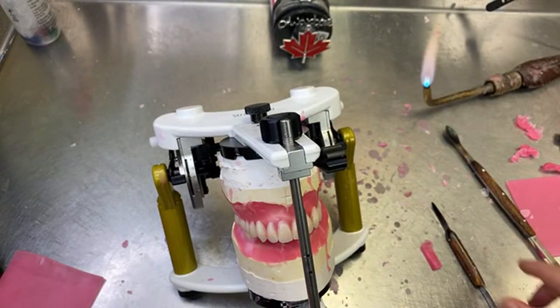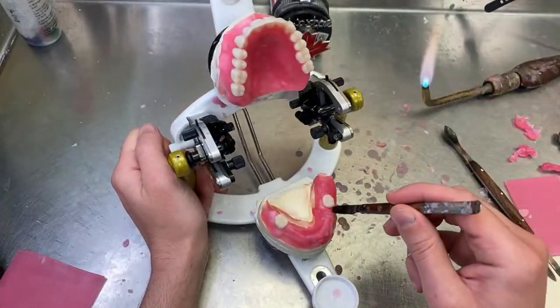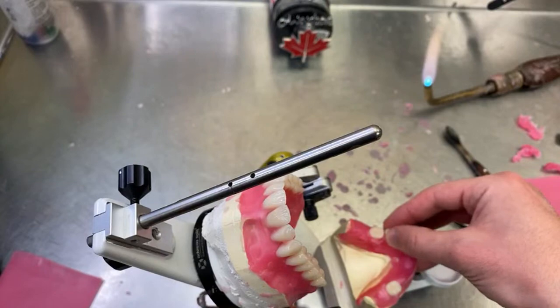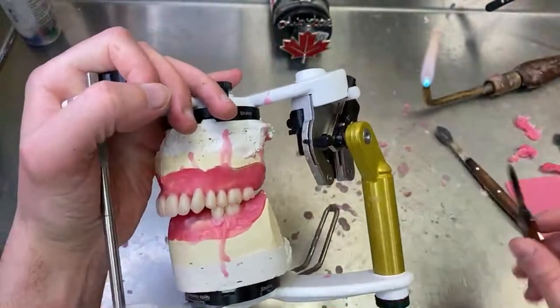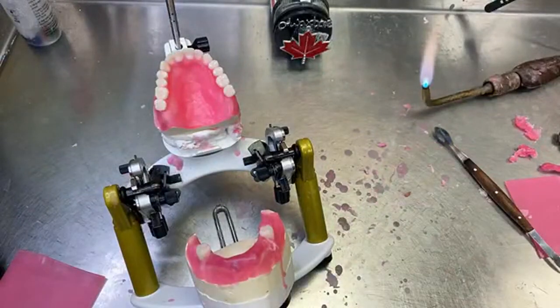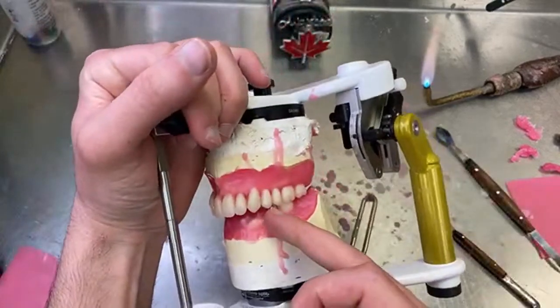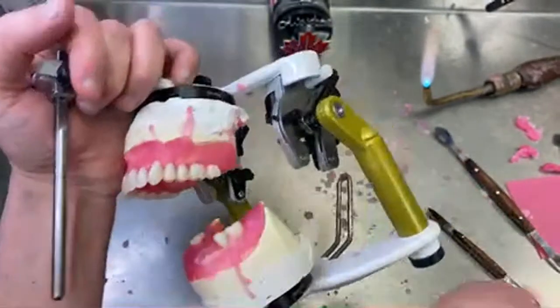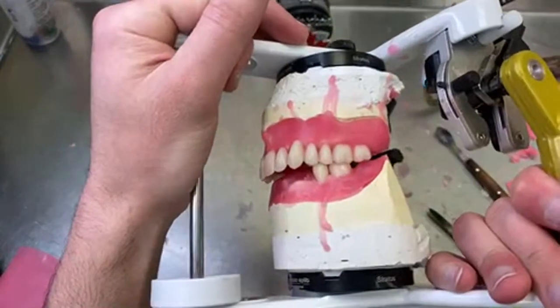And that's how I always work, starting from the back and come to the front. If everything is in a place, you will have the exact space for the anterior lowers, so we don't have to worry about that. This one here, oh, wait a minute, I got this backward. So the second premolar will be sitting right between those two here. So you see here, it goes like that, exactly in the middle.